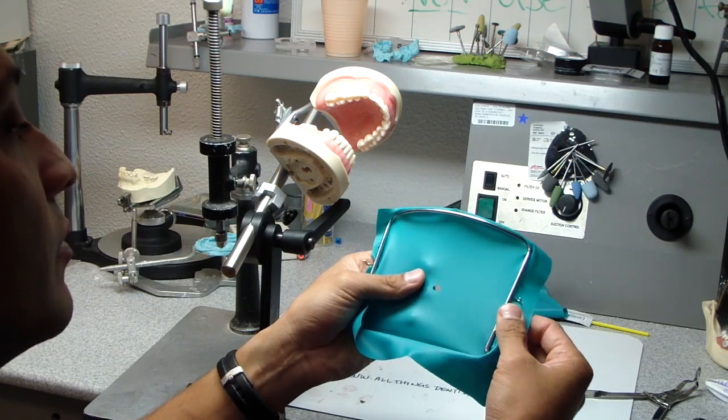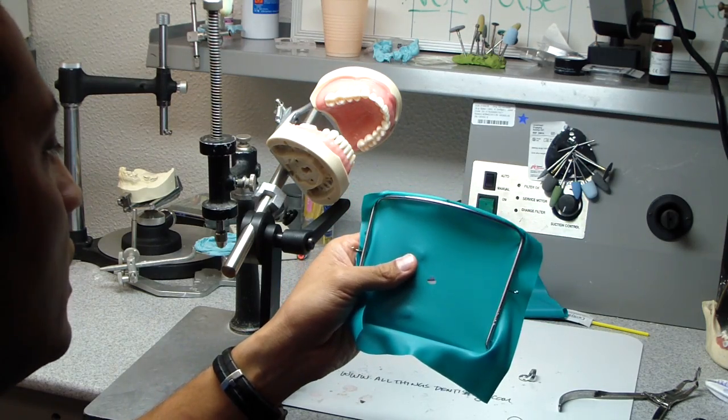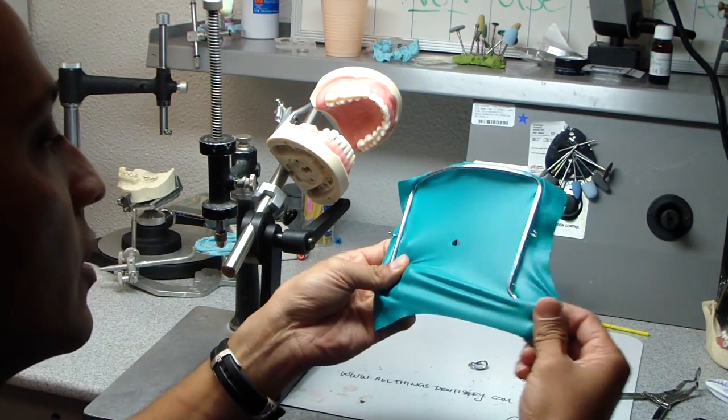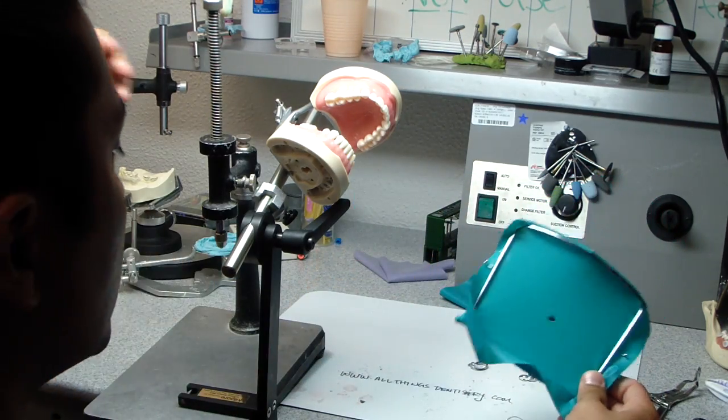Yep, the umbrella for the mouth. These are really stretchy, non-latex rubber dams I recommend, so I try to get my mitts on.